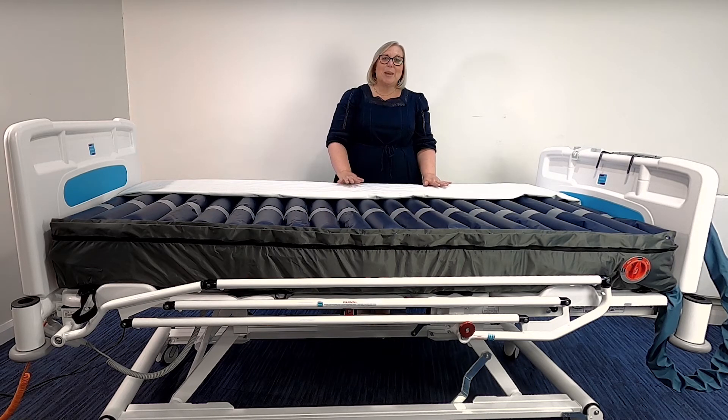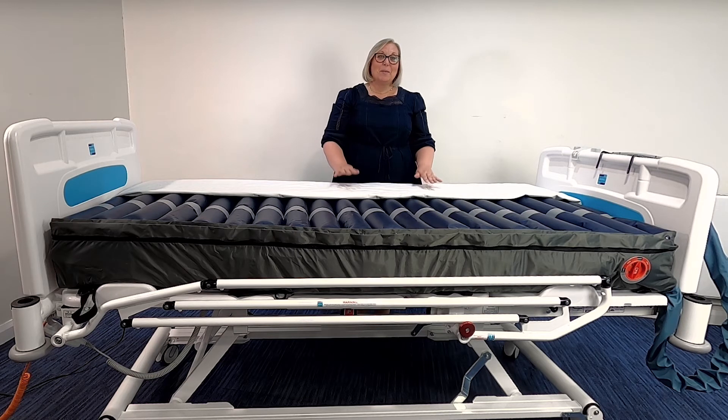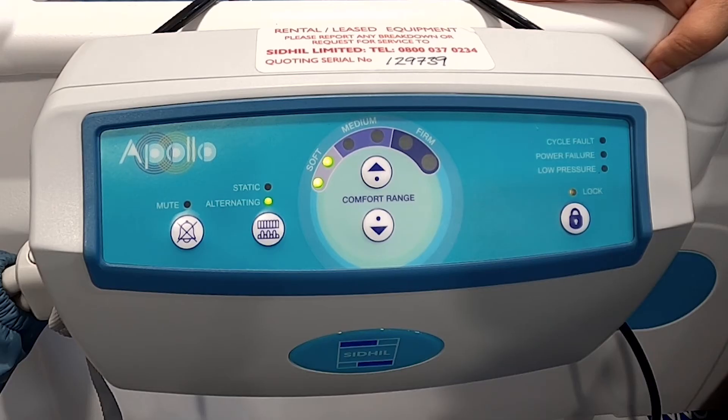The mattress is made up of 20 air cells. Three are the static head cells that support the patient, which also helps to eliminate feelings of nausea. The remaining 17 cells are the alternating cells. The mattress cover also has a white inner substrate on the underside of the cover, which you can see here. This helps with auditing procedures by making it easier for staining to be identified, showing that the mattress cover has become compromised.